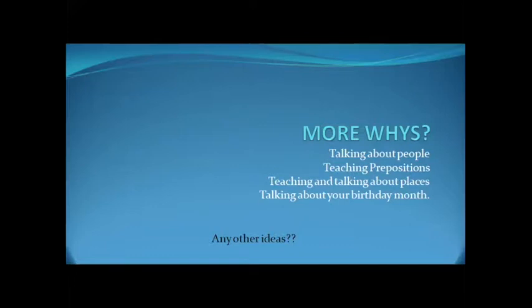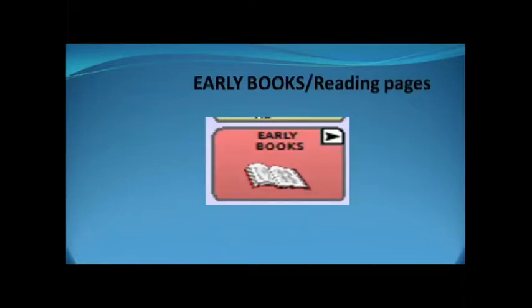when you hit the lock, it locks it in. You don't have to click it and then unlock it again. You don't have to hold it down. Right, exactly. It toggles back and forth. Right, if the user had to do something, in case they go over and hit it to unlock the screen. Right. Okay, good to know. Yeah, it just toggles back and forth.